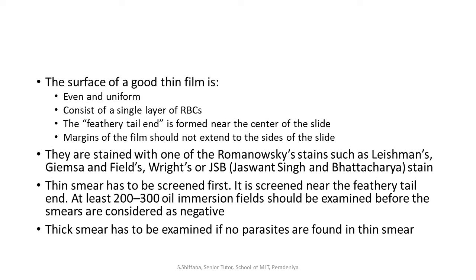But in the case of Giemsa stain, before adding the Giemsa stain, we have to do the methanol fixation, because in the case of Leishman stain, we prepare the Leishman stain in methanol. That means we add the Leishman powder into concentrated methanol, so it contains methanol.